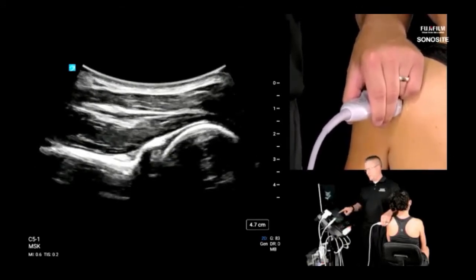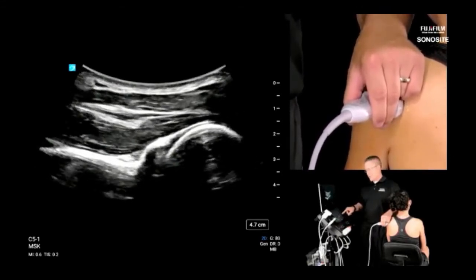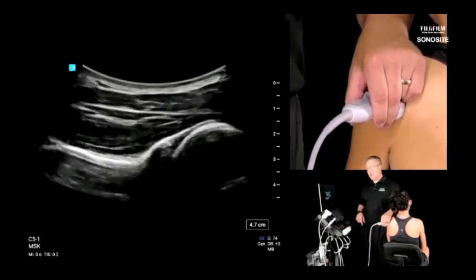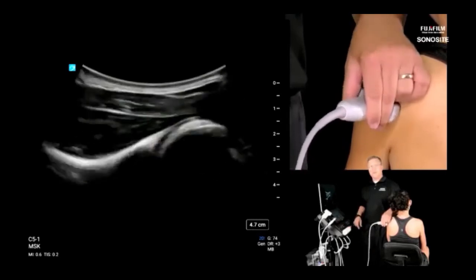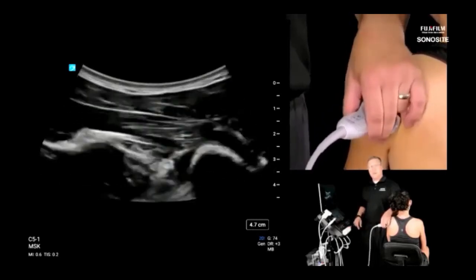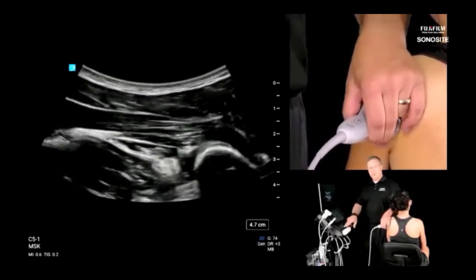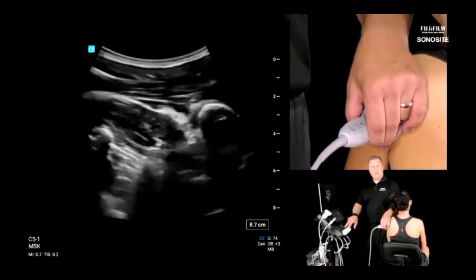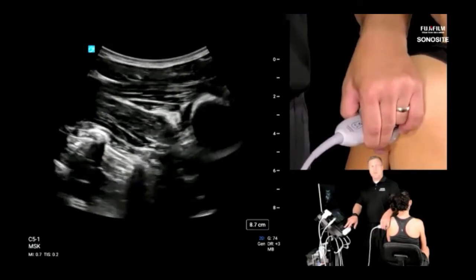Well, no, I kind of like that. Good on my end. It's a little hot on the Zoom side, so let me just soften that up just a touch. There we go. So different looking image, much more penetration. For example, I think I can probably drop underneath the glenohumeral and probably hit her chest wall and ribs posteriorly very easily.